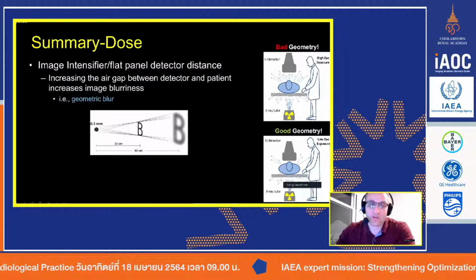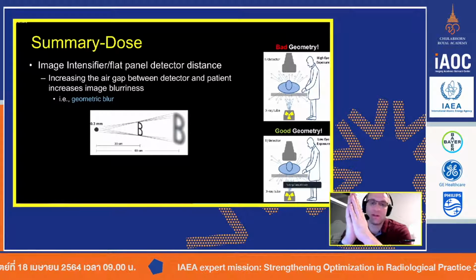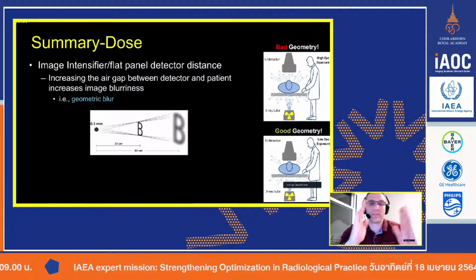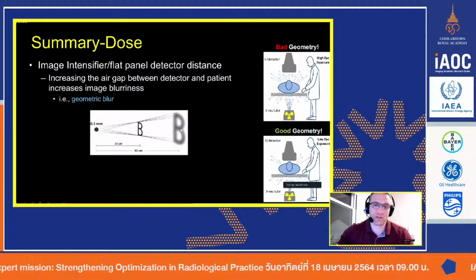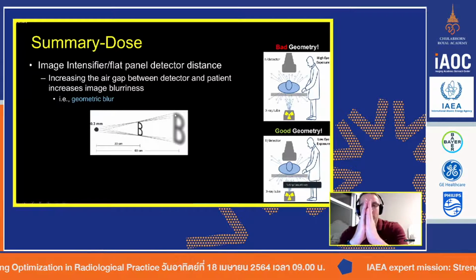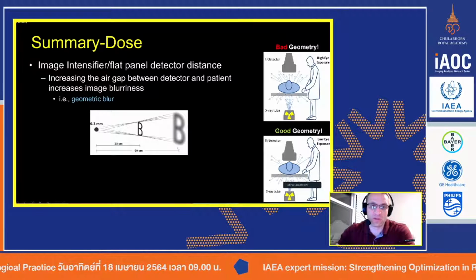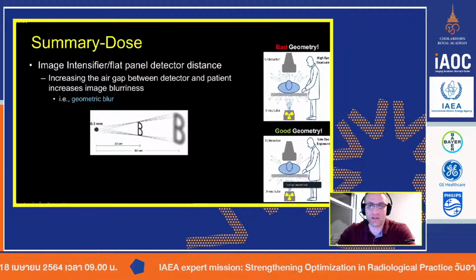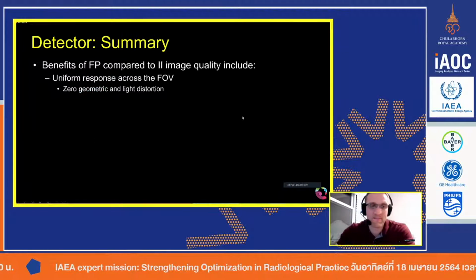And we'll talk about this especially in X-ray and mammography, when you take an object and you move it away from the detector, you get what's called a penumbral effect, or this blurring, geometric blurring around the edges. The closer you put the object to the detector, the crisper that image will look. So not only does the contrast improve in this geometry, but so does the spatial resolution.